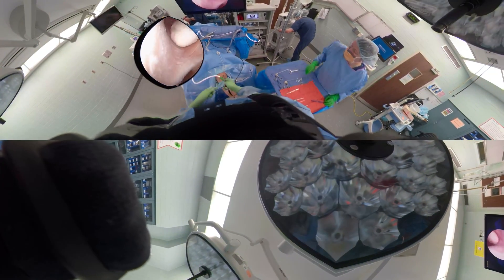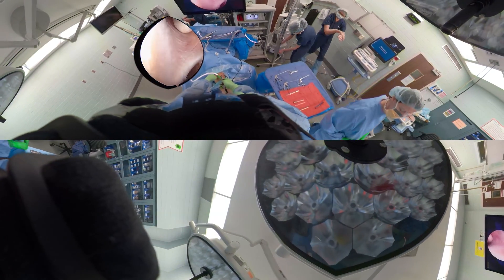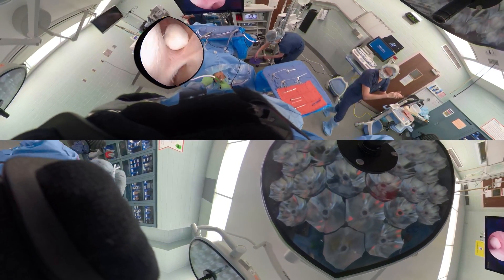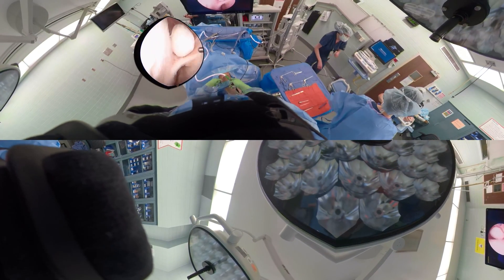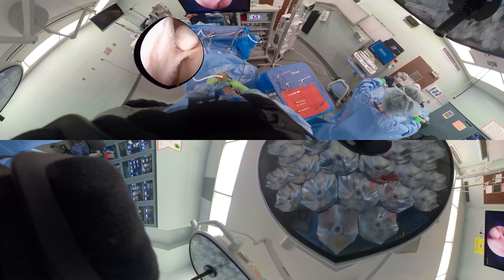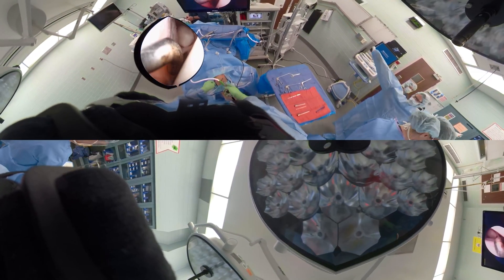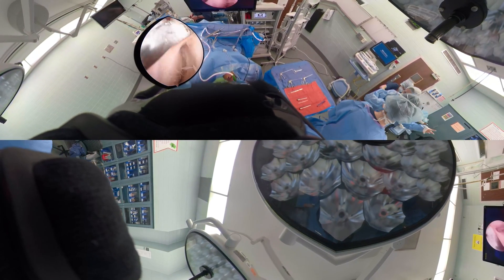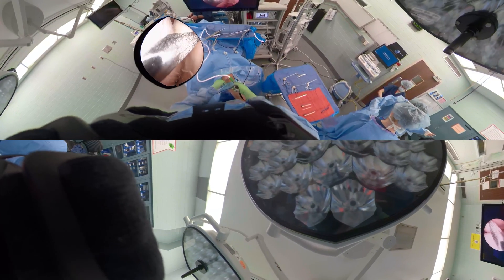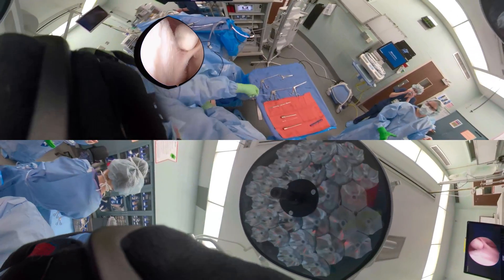Now we're looking with the scope lateral at that loose body, but we can't really reach it from that aspect. We've made the medial portal and we are probing in that area, but you can see the difficulty — to get the loose body out, we have to have the working portal directly lateral.